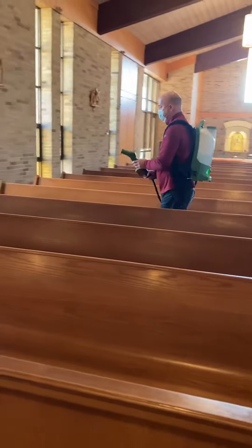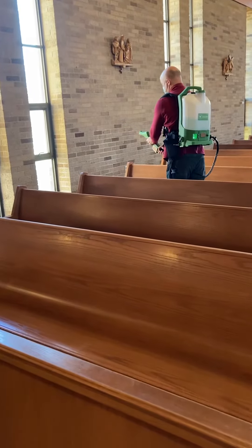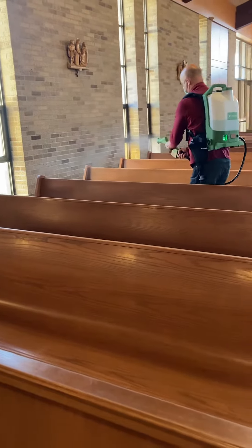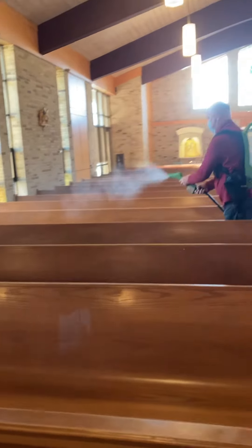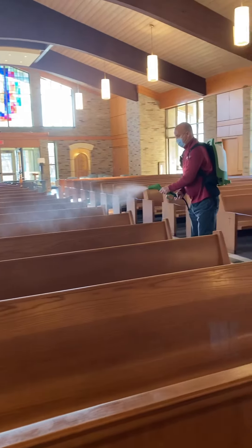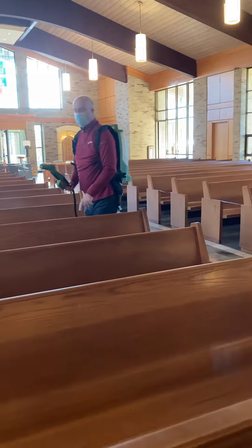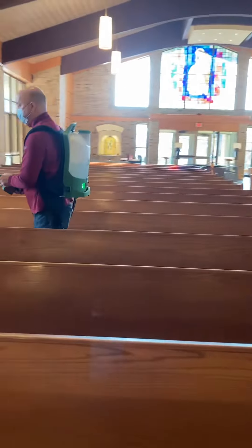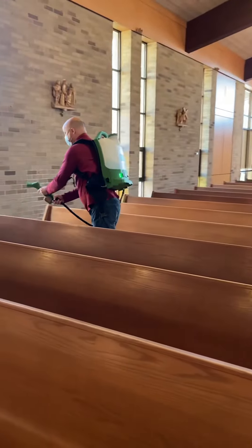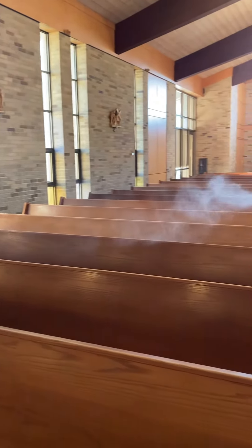So then all you have to do is just do a fine mist quick over it. It gets everything. It gets at the end too, because people's hands will be on this one here. Then you just go back and do the top of that.